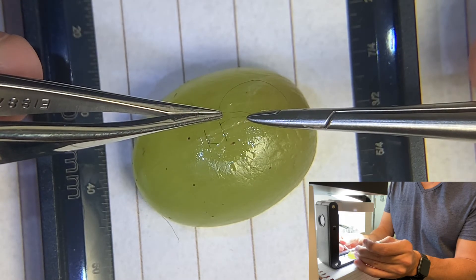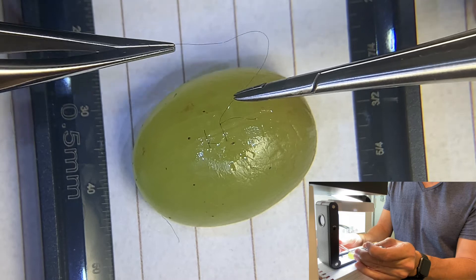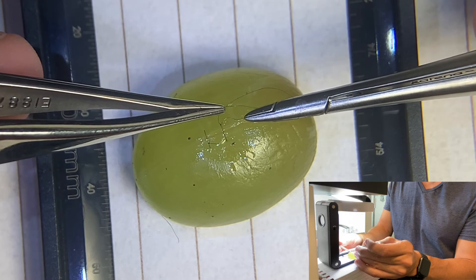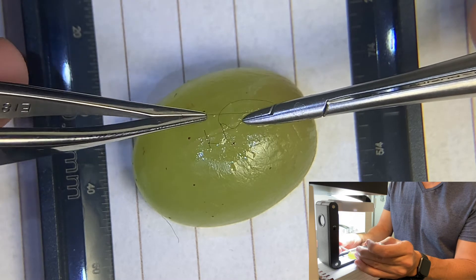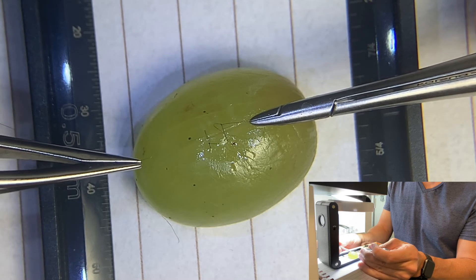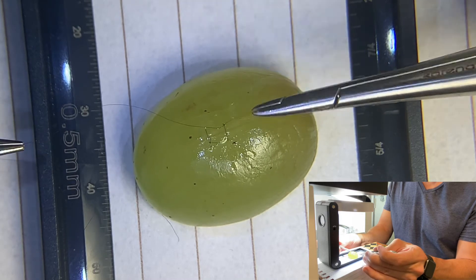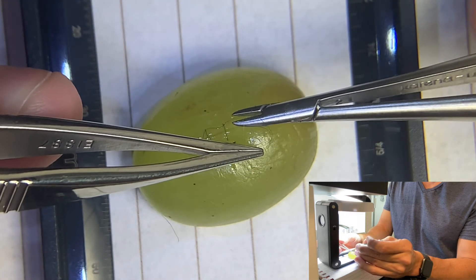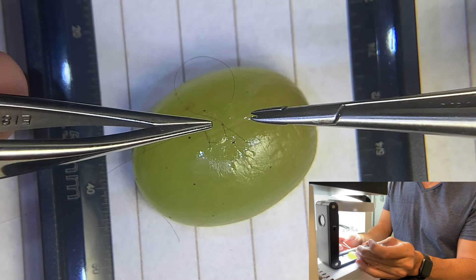For this next braid around the needle driver — let me do it again. I come around it, pick up the tail, and point right at the knot. My needle driver is pointed right at the knot. I'm pulling 90 degrees away — not 180 degrees, 90 degrees away. The loop slips right over the needle driver and then cinches down on the knot. That's pretty. Do the same thing with the last throw — same thing. That makes it look pretty. So now we've got our 3-1-1.